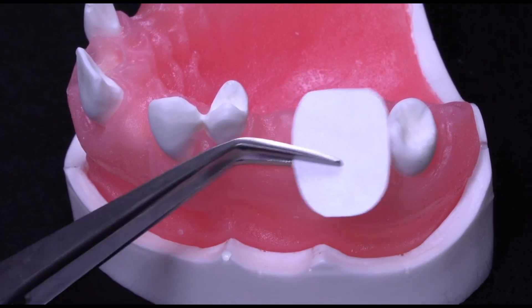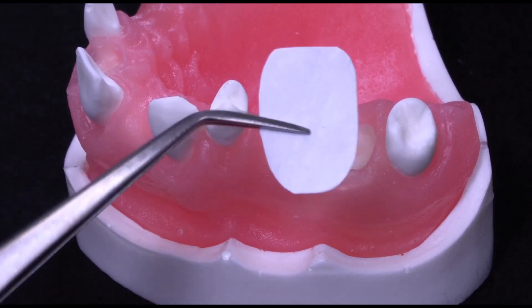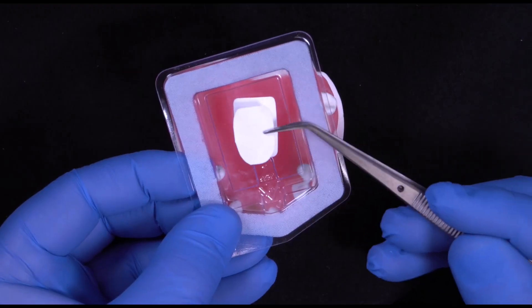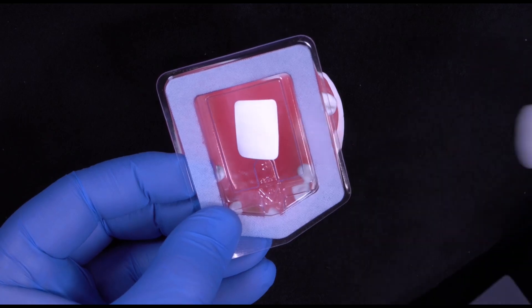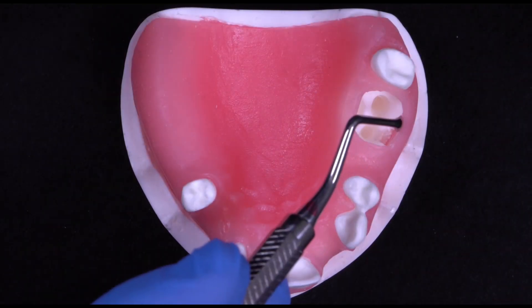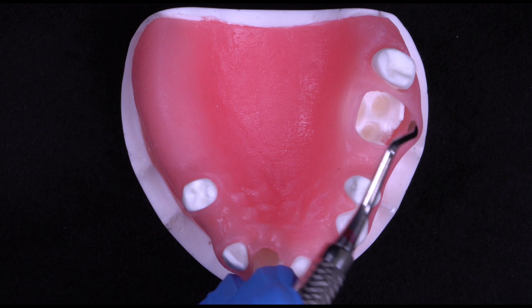Once the template is at the desired size, it can be used to transfer the size and shape to the collagen membrane. Careful reflection of the soft tissue, including the periosteum, is needed to expose adequate bone entirely around the defect.